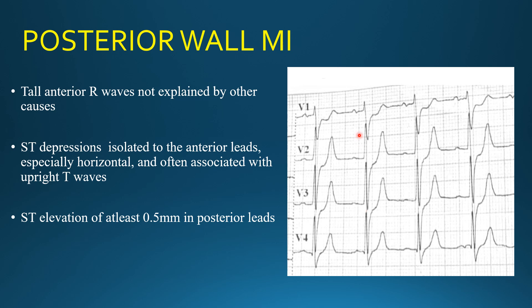Looking at our patient, we can see R waves in V1-V2, but they don't seem to be too tall. There is a deep S wave, so the R wave is not tall enough to definitively suggest posterior wall involvement. However, we can see horizontal ST depressions, and these are followed by upright T waves — so this criterion is met.